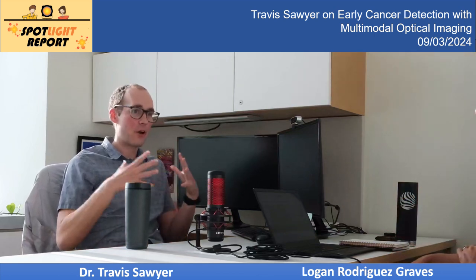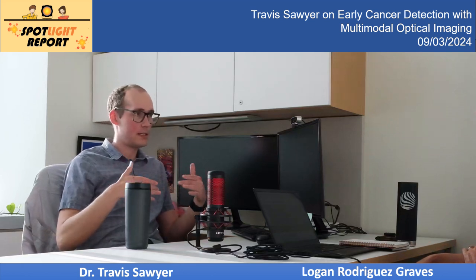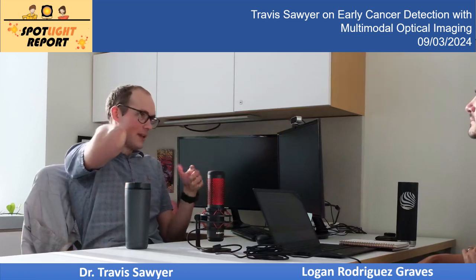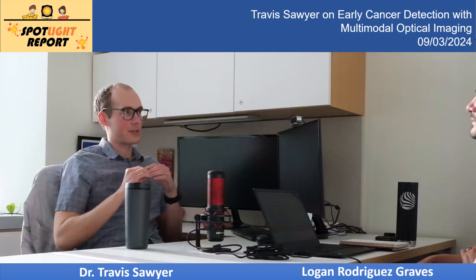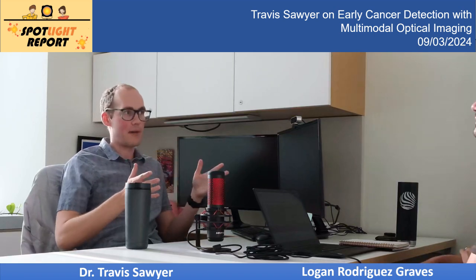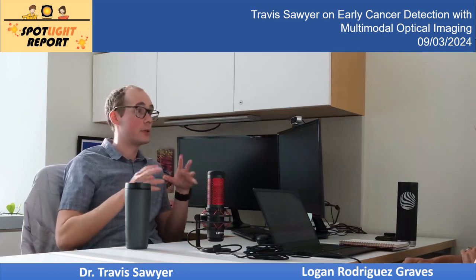I think in the broader sense, definitely. In that, yes, it can penetrate somewhat deep into the tissue, but nowhere near as deep as ultrasound. Okay. Or any radiological imaging modality like X-ray. And so that's always going to be an issue with optical modalities, is maybe 0.5 millimeter. OCT can go a bit further, maybe 1 millimeter of good data.